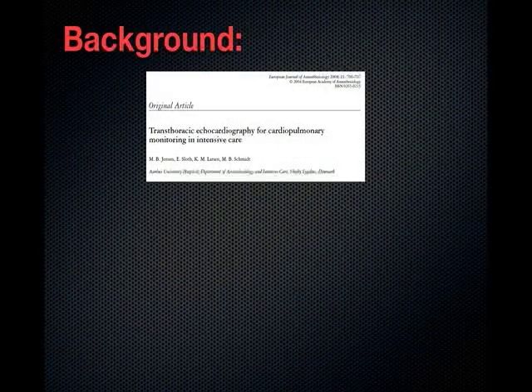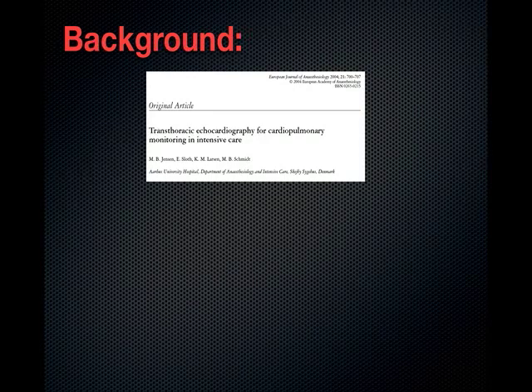Some background about the FATE exam. Originally in 2004, this exam was described, and transthoracic echo for cardiopulmonary monitoring in intensive care. This was a study where they taught intensive care physicians how to use the FATE protocol, and then had them incorporate the FATE protocol into their daily routine, and they studied the outcomes.